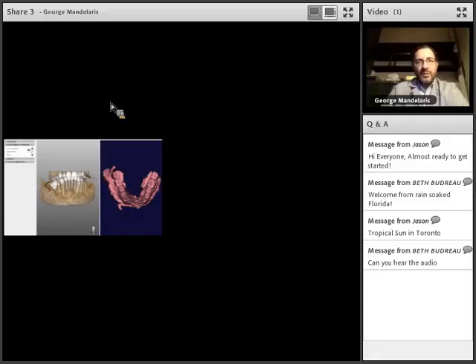In today's digital world, we'll do an intraoral surface scan using the Trio surface scanner. I'll send that to the laboratory, and they'll do a digital diagnostic wax-up, which they'll send back to me as an STL file. Now I'm going to import that into the CT scan using the software, so that when we plan the implant surgery, we're planning with the prosthetic end in mind, the optimal final tooth position.